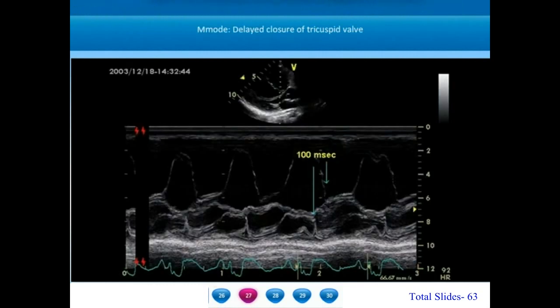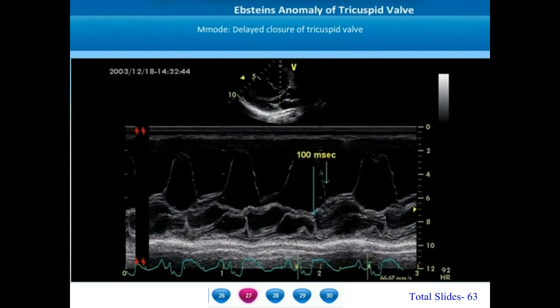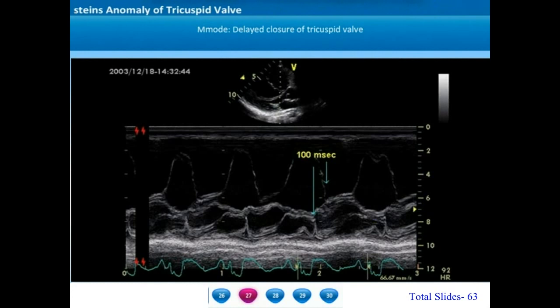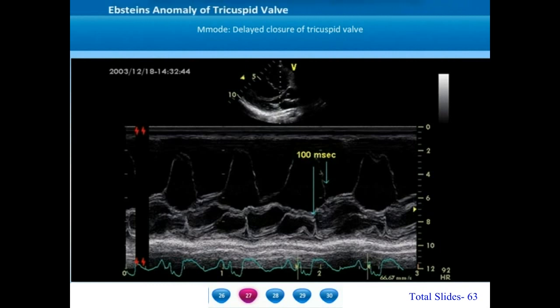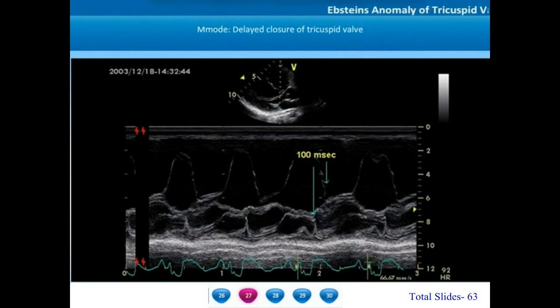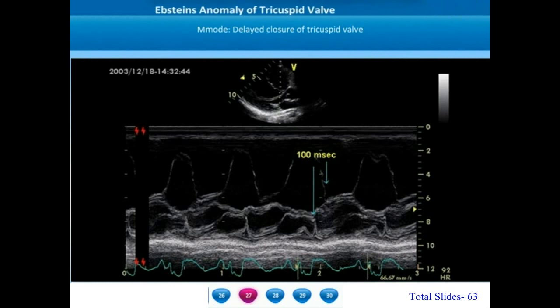One of the auscultatory hallmarks of Epstein's anomaly is a split in the first heart sound, which is almost never appreciated in a normal heart. The split is caused by a delay between mitral valve closure and tricuspid valve closure. Since the anterior tricuspid leaflet is large and mobile, it moves like a sail slowly during right ventricular systole and coapts with the other leaflets much later after systole starts. This results in a mitral-to-tricuspid valve closure time delay, also called the MCTC time delay. On M-mode, we can appreciate a time delay of close to 100 milliseconds between mitral valve closure and tricuspid valve closure, resulting in splitting of the first heart sound.